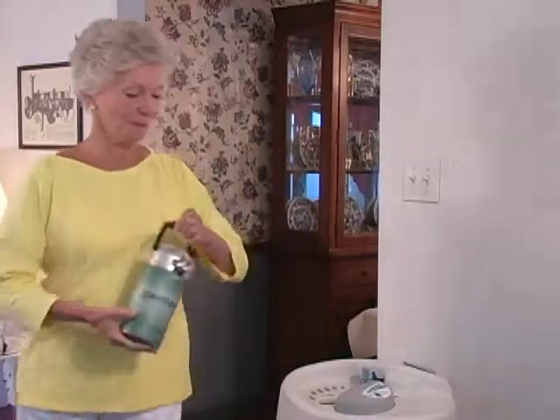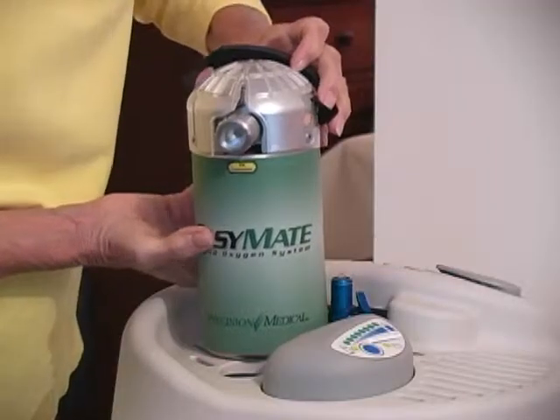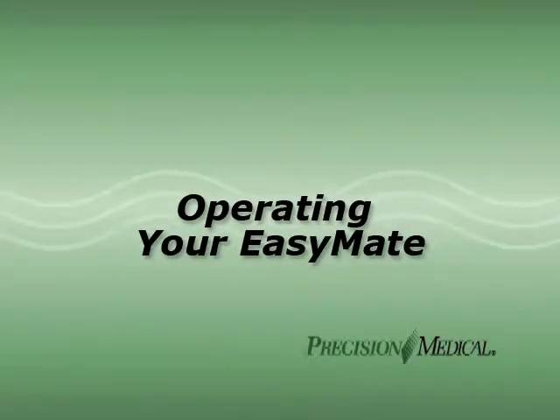Safe operation of the EasyMate is simple with the help you've already had from your home care provider. This video offers step-by-step instructions and troubleshooting help to keep your EasyMate performing properly.